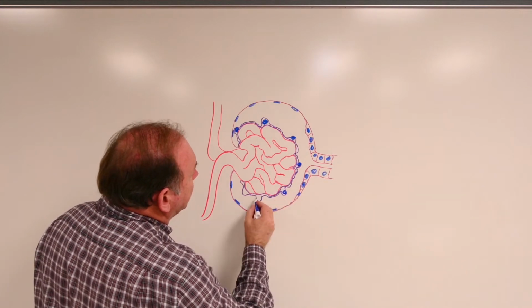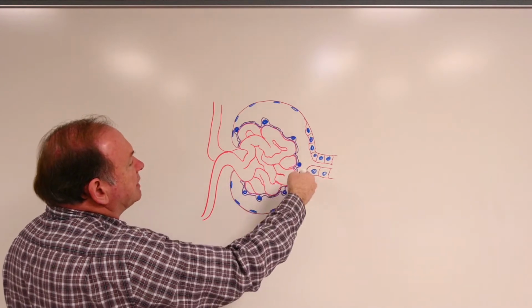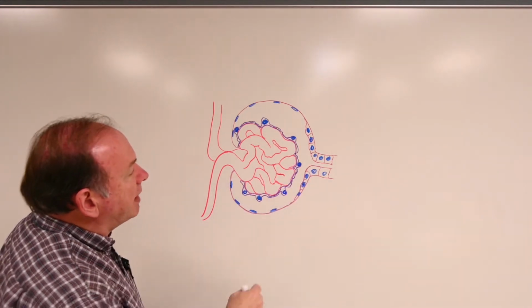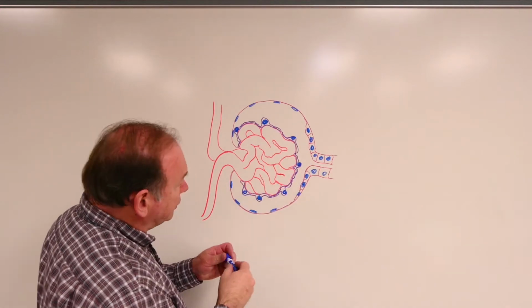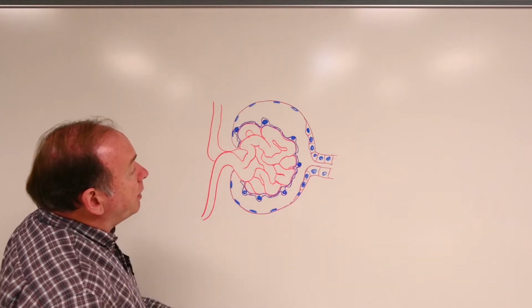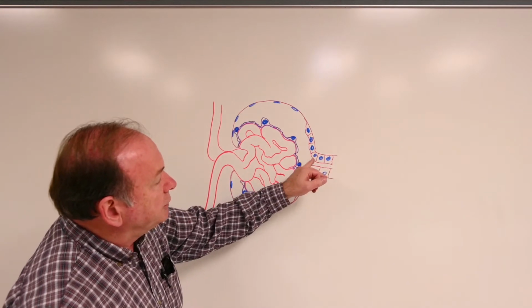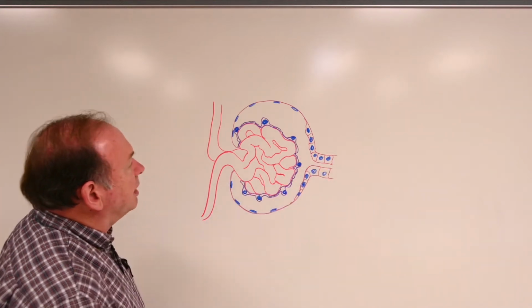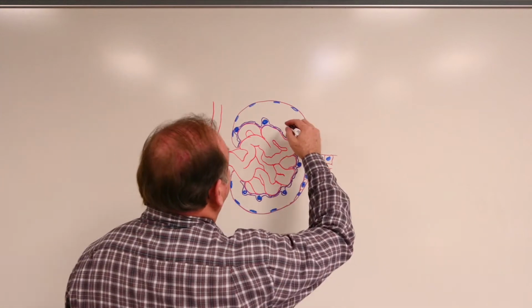So when we talk about these in the laboratory, we'll be looking for podocytes that kind of stick out to the outside of the glomerulus and have obviously rounded nuclei that extend out toward the space of Bowman's capsule. So podocytes, simple squamous cells, cuboidal cells as we go into the proximal convoluted tubule. Let's see, we can label some things here, I guess.